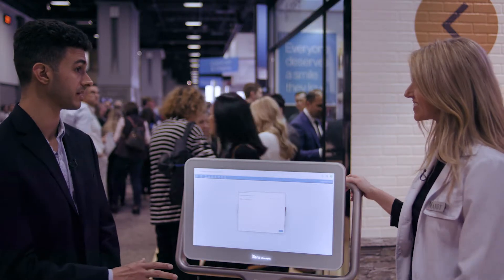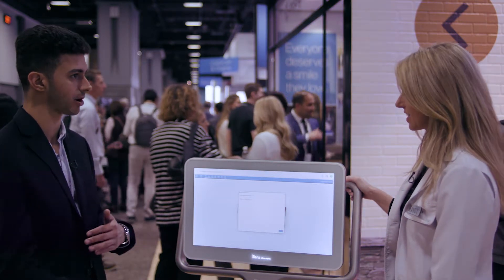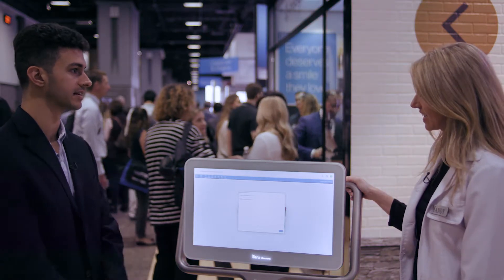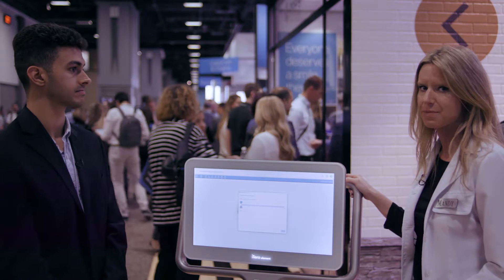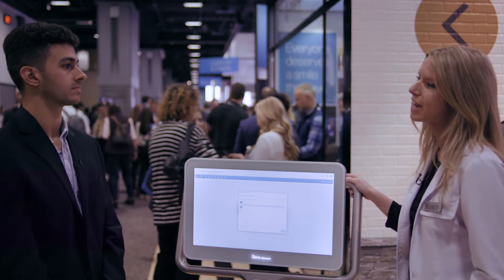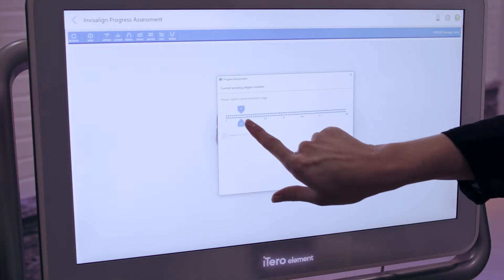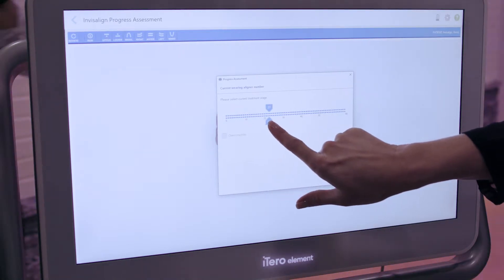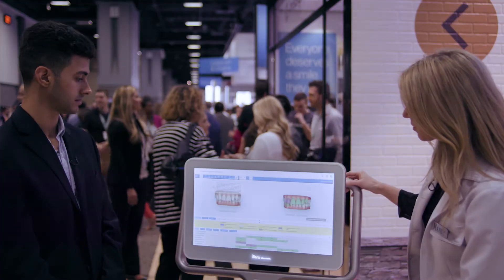At this point of the treatment the patient has already come back to see how they're tracking, so this is as part of a follow-up consultation? Yes, and the doctor can use it whenever they want to see exactly what's happening — if they want to use it for a refinement, or if that patient has admitted to not wearing aligners as often as they should. They can also use it as a patient education tool, however they would want to.